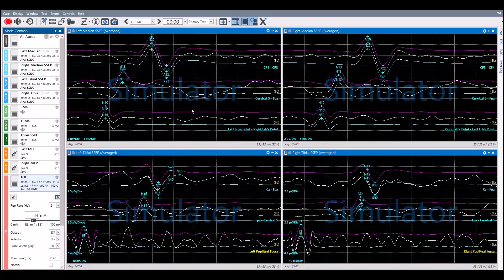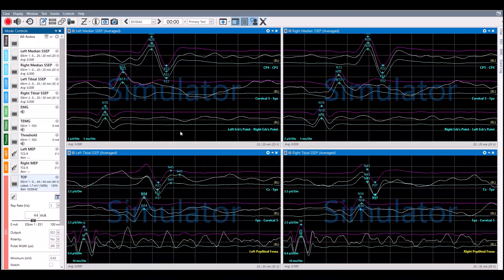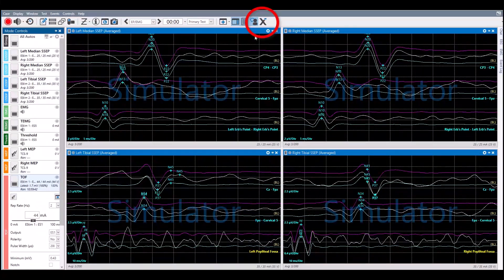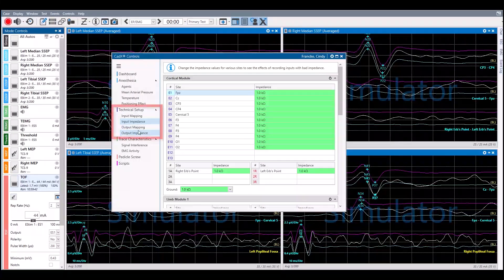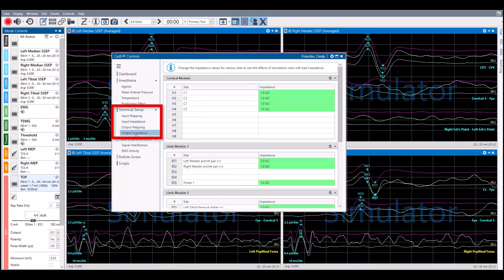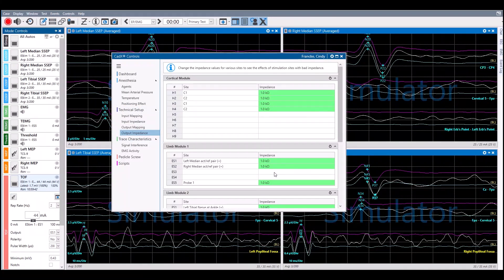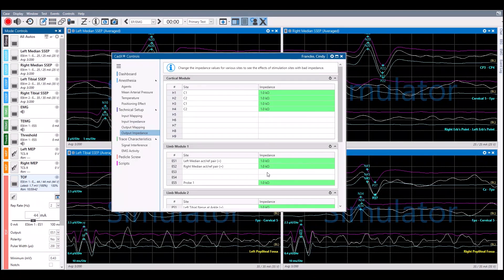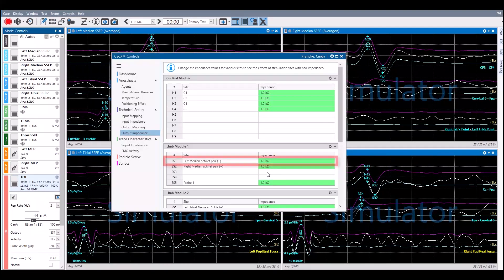To make changes for the stimulating electrode impedances, click on Output Impedance. The default impedance is 1 kOhm. Click on the electrode that changes are to be made for and choose an impedance value or a salt bridge. In this scenario, the left median nerve stimulator has a salt bridge.